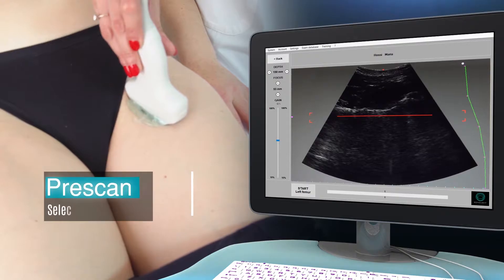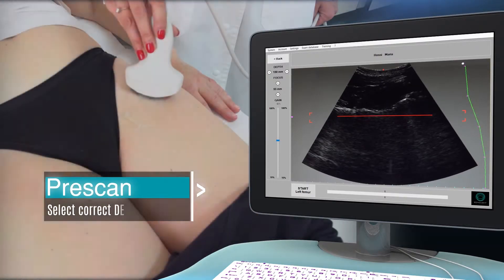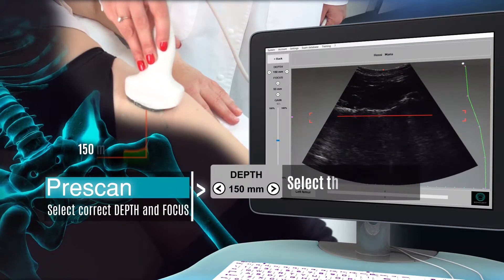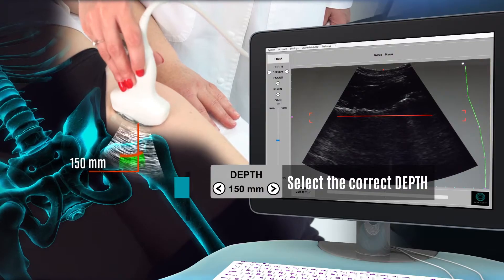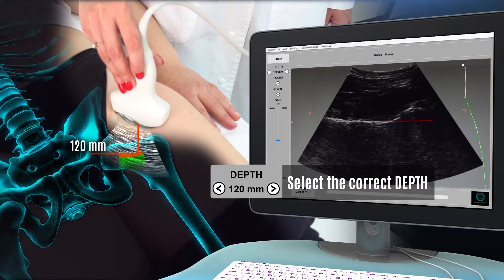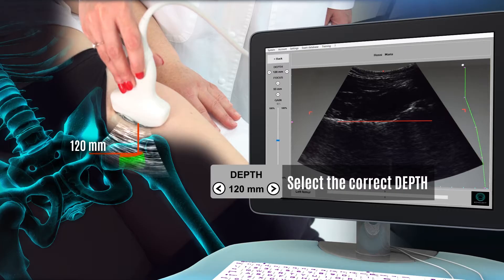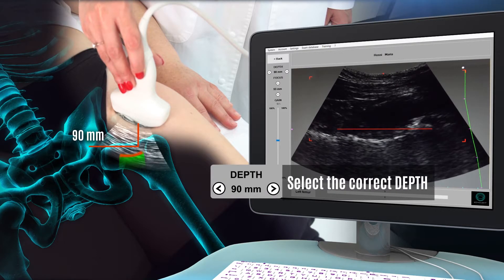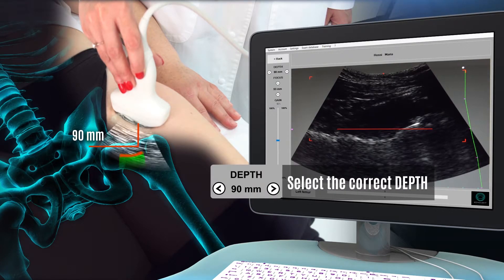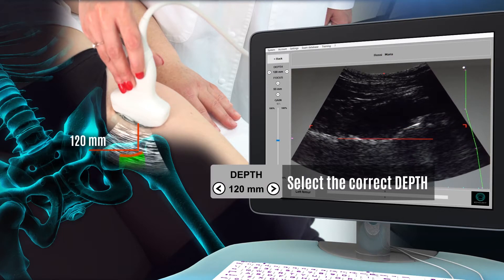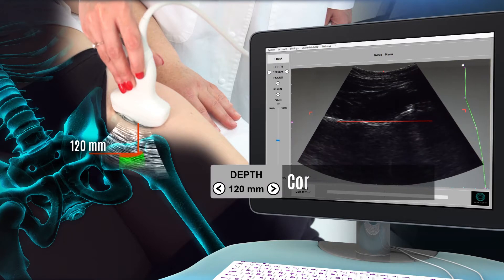Make a pre-scan to set the correct depth and focus. Select the depth of scan to have the bone interface in the centre of the echographic view. Select the depth of scan using the left and right tabs or clicking on the left and right buttons on the ECOS Studio interface.